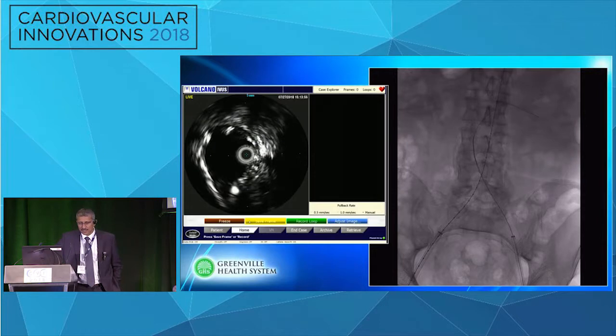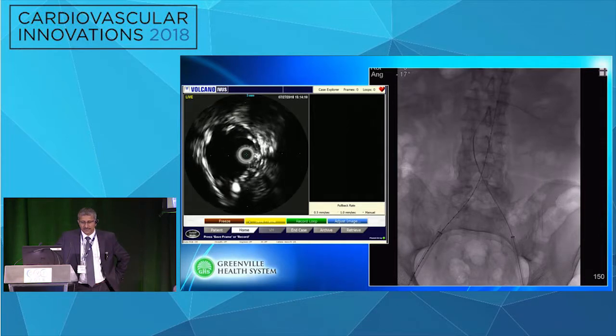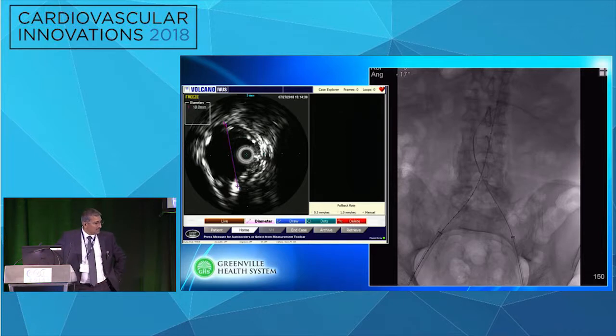Because of the calcifications on CT scan, we wanted to get a good measurement. We can go ahead and measure there, please. Very nice IVUS images. Thank you. Based on our preoperative imaging, the CT scan showed a good length on the neck, which was about 2 centimeters. So I think we'll have good seal. We just want to double check. Yep.